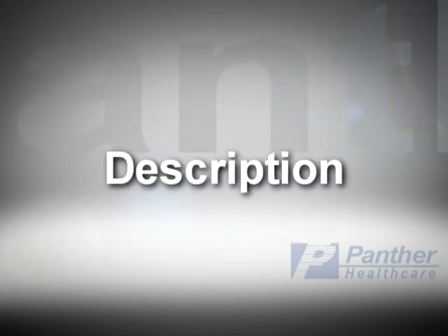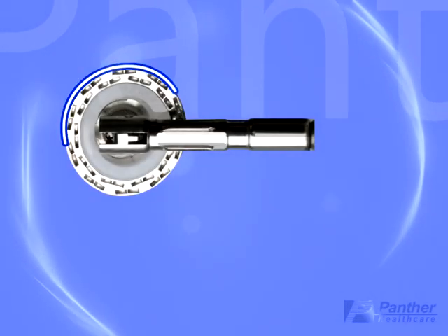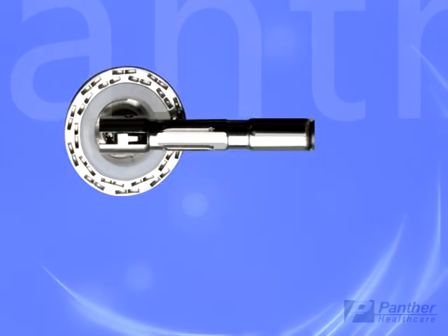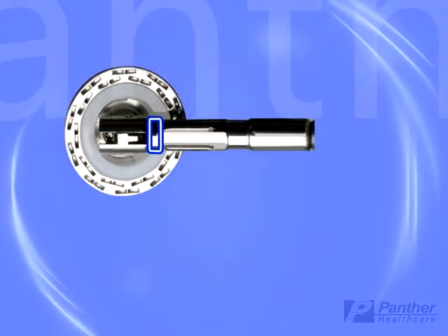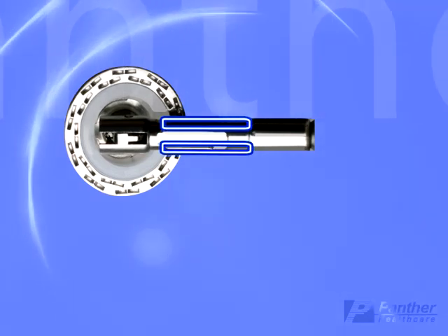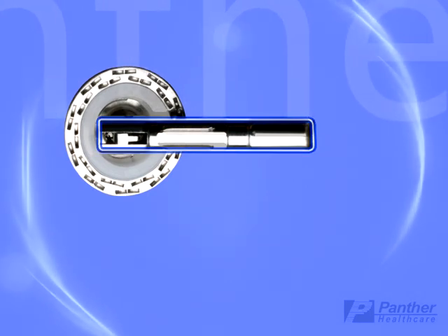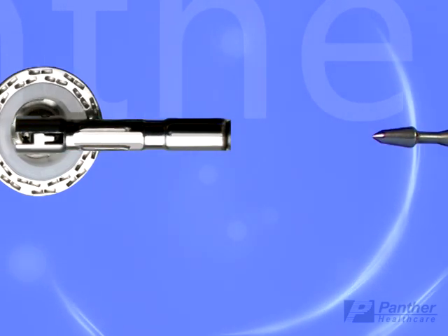Description. The detachable anvil assembly is located at the distal end of the instrument. The purse string notch and the locking spring are directly behind the anvil and are integral to the anvil shaft. This shaft fits over the retractable trocar.